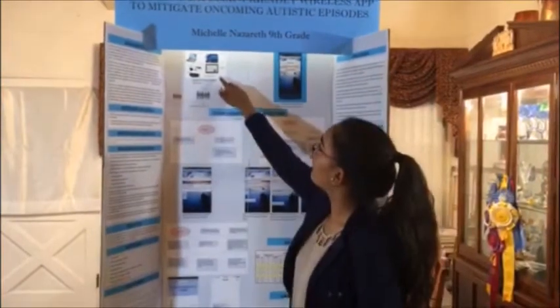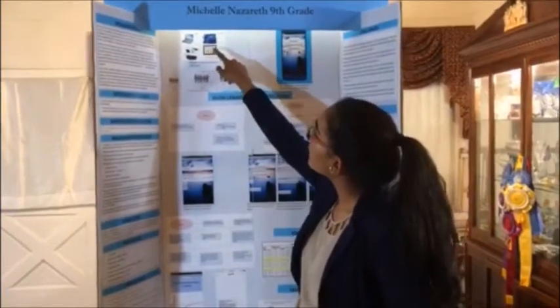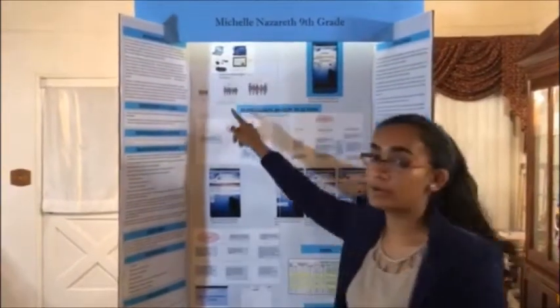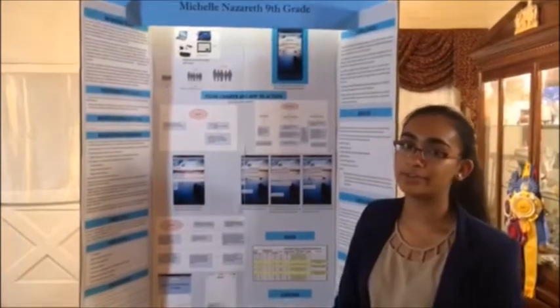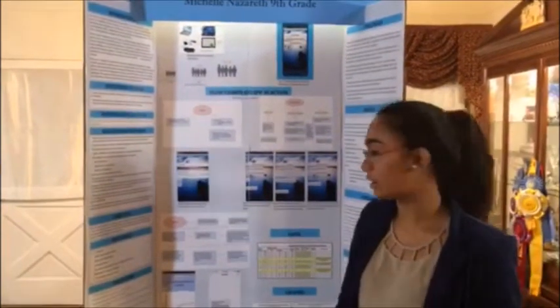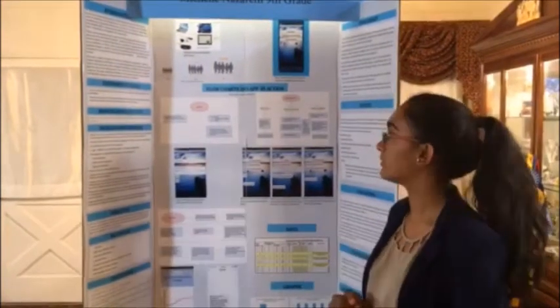Here's a version of my device last year. As you can see, it's tethered to a computer and it has a lot of breadboard and wires. So this year I really wanted to improve on this and be able to make it a mobile version where you could take it on the go with you and still have it recording your heart rate and being able to track all these symptoms.